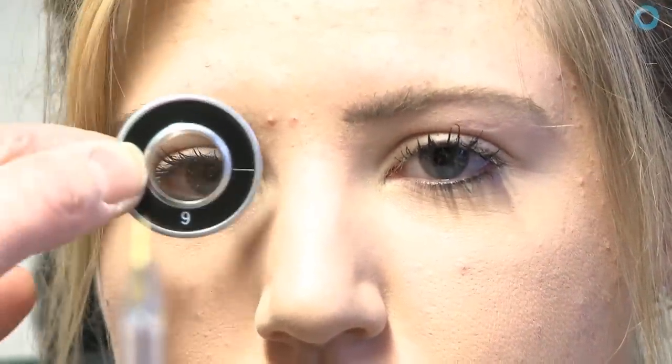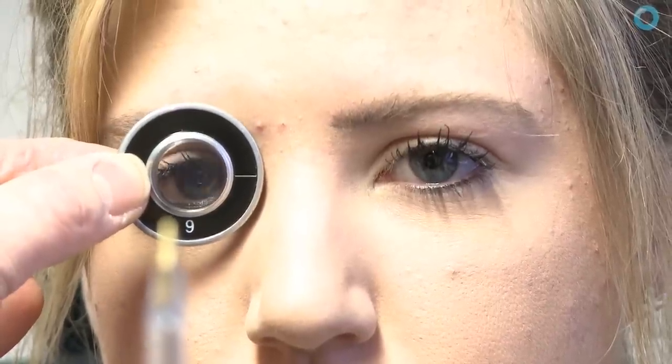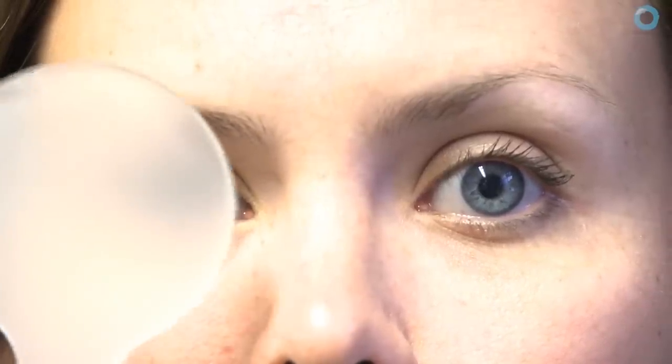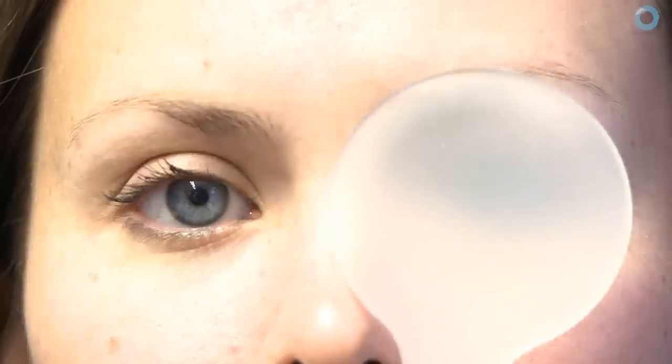According to Dr. Barnard, there should be no differences between the phoria in either eye if you've got a patient with completely normal binocular vision, and that does seem to be the case. So if you get a difference in phoria between your left and right eyes, you need to have a good look and find out why that is.